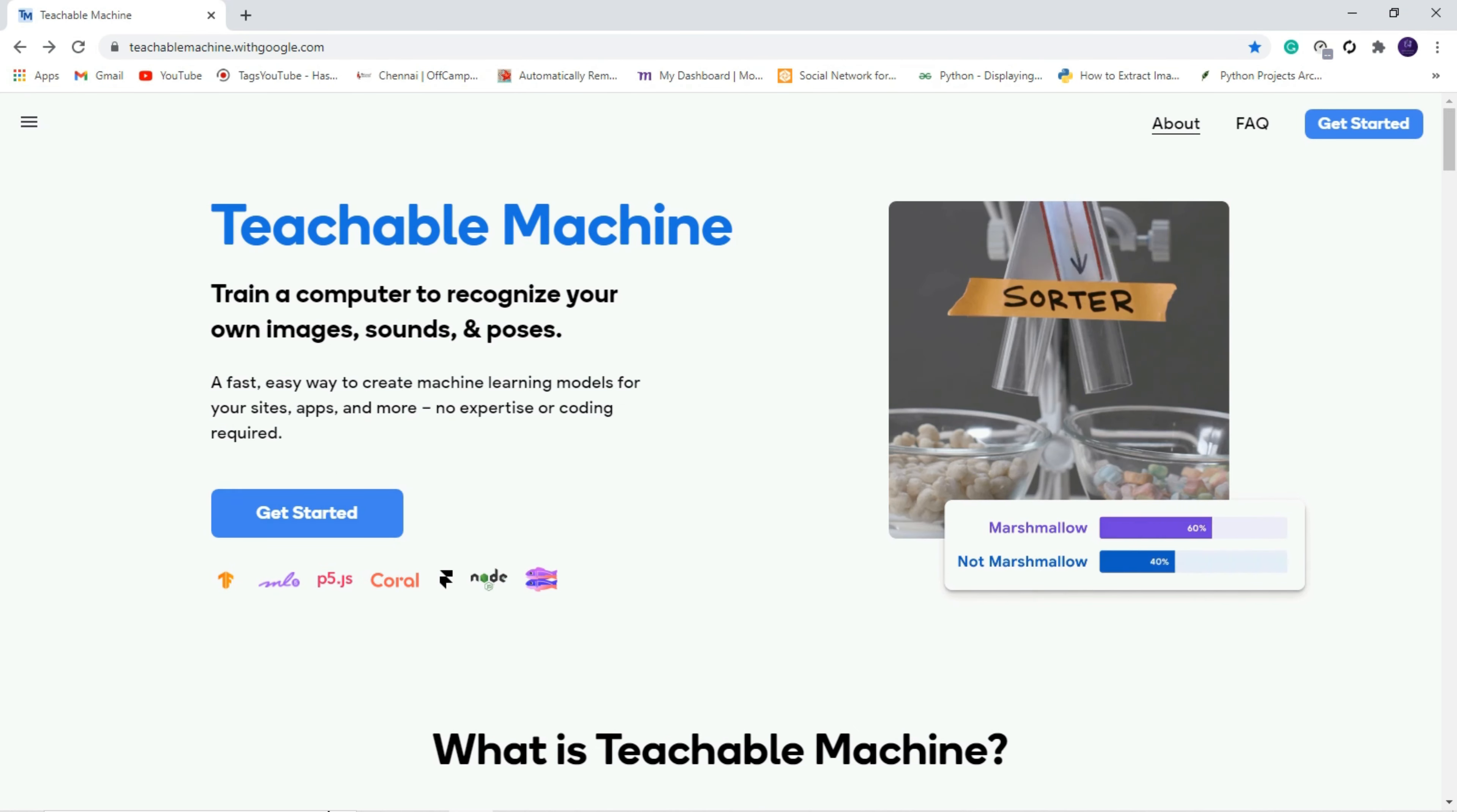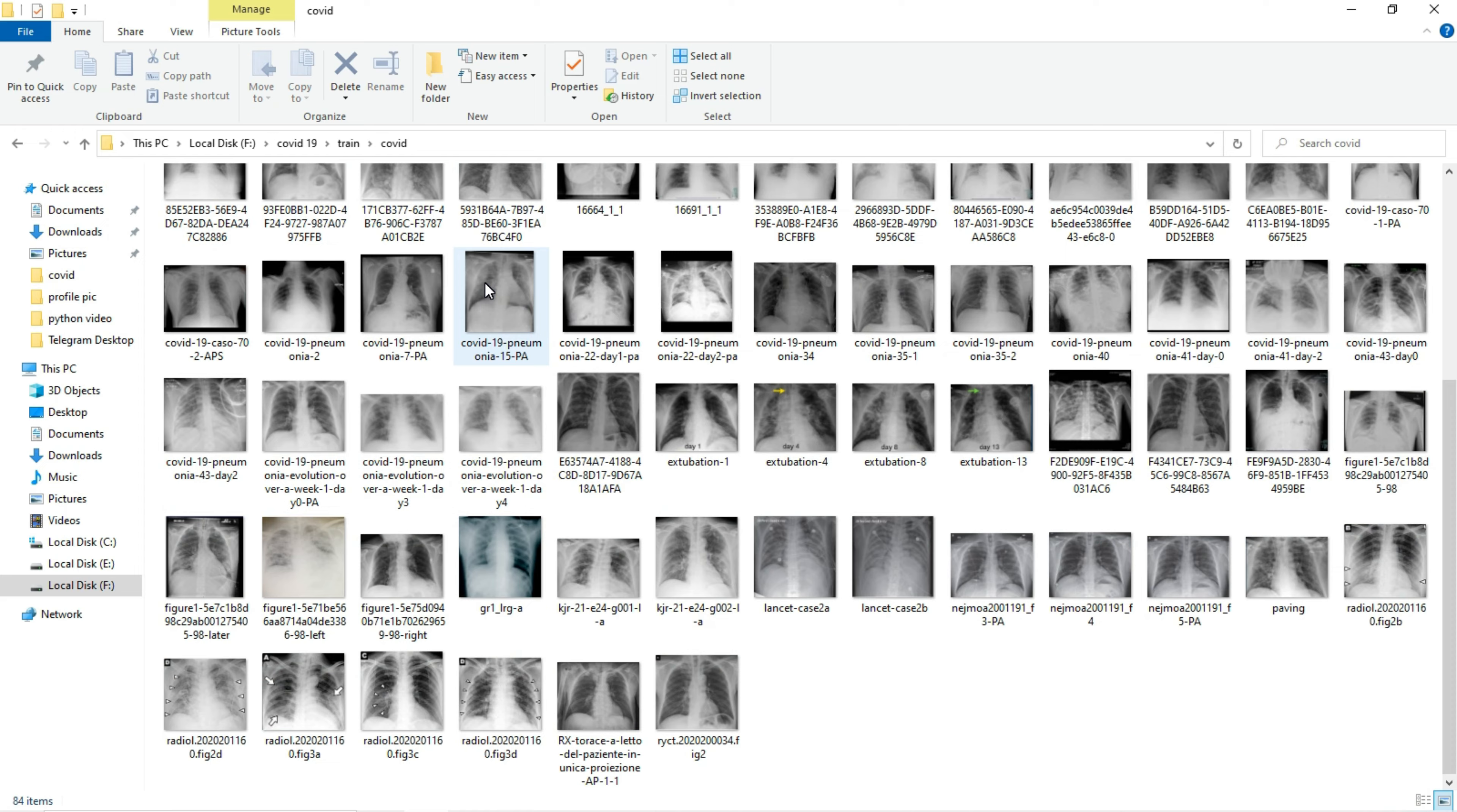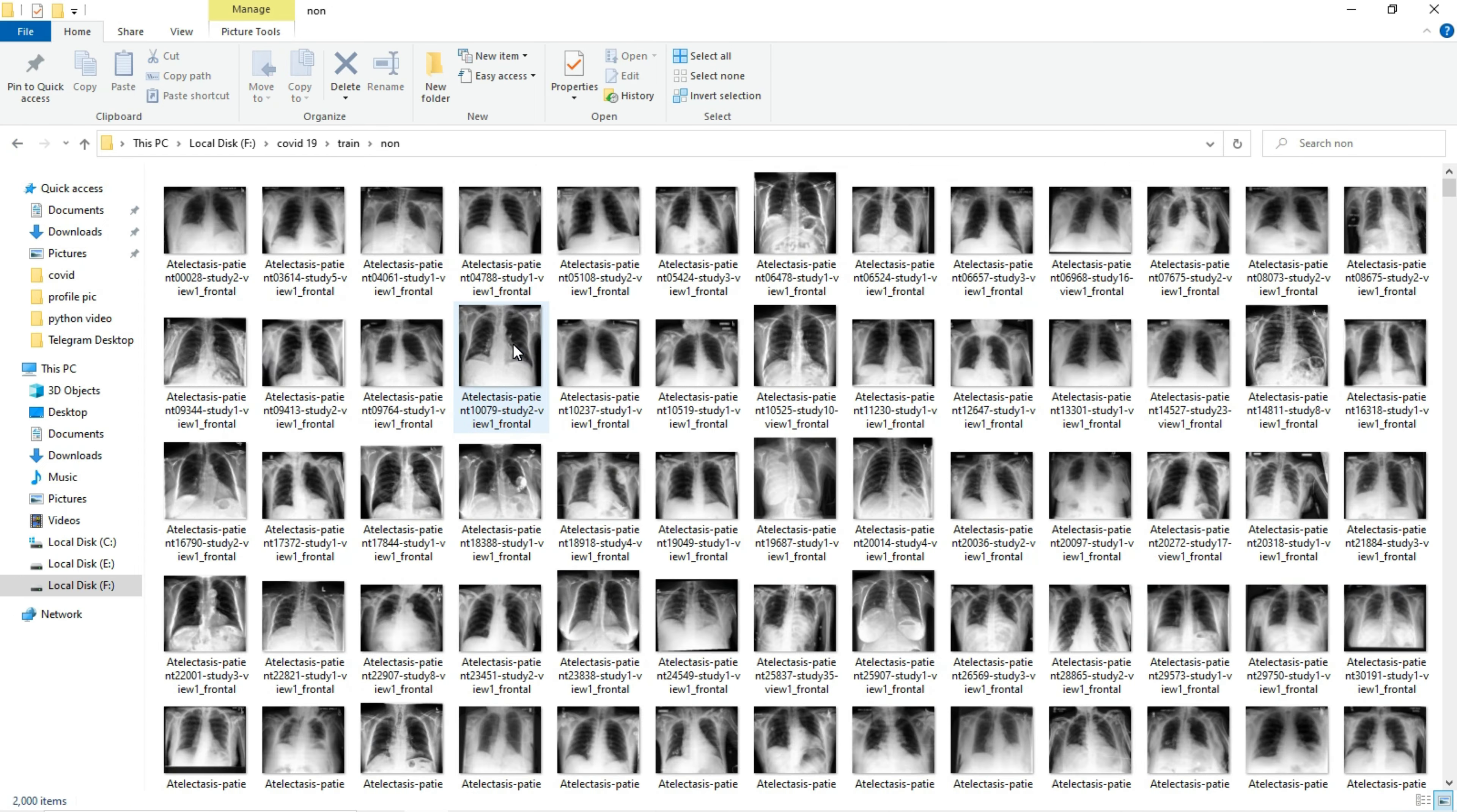First I will show the sample images. These are the sample images for COVID and non-COVID patients. These are the X-ray images for COVID patients and these are the X-ray images of non-COVID patients. You can see the X-ray of non-COVID patients.